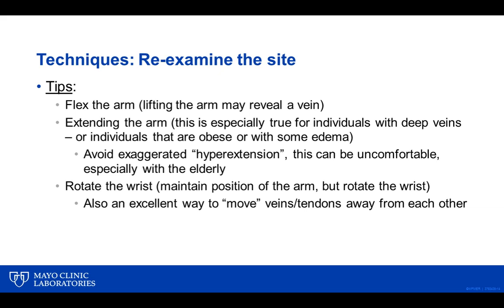Just to quickly clarify something here, a comment came across regarding the thumb side of the wrist and CLSI recommending not to use it. That's accurate, that's true. What we were talking about is locating that cephalic vein, and a great place to find it is down in the wrist area. Once you find that, you can look for where that cephalic moves into the hand, or return up the arm palpating and actually get away from the wrist area.